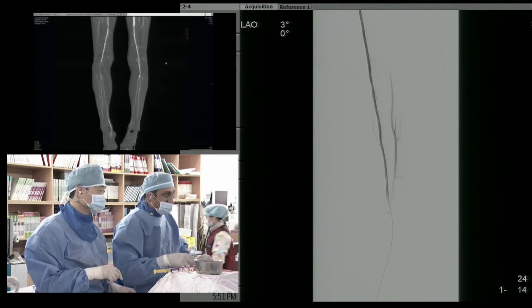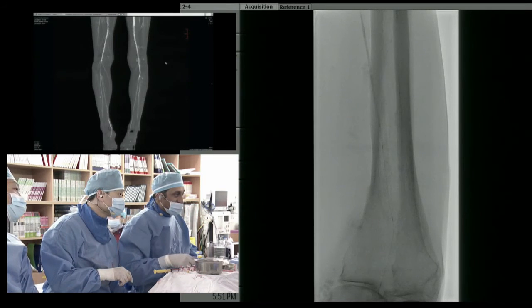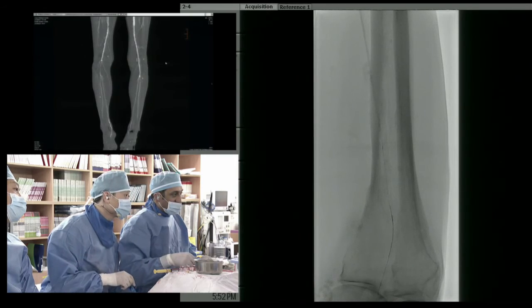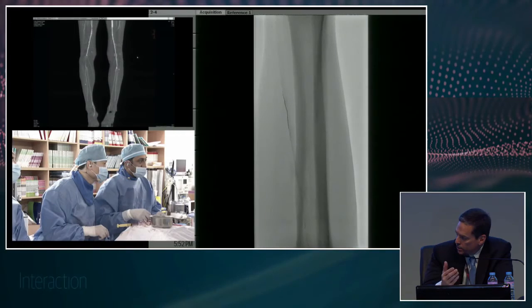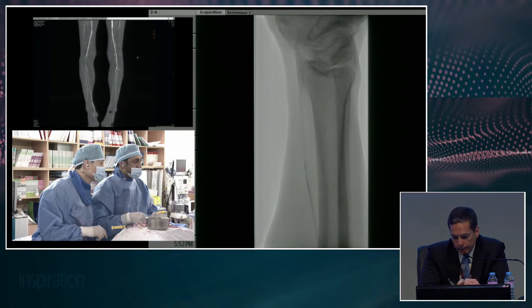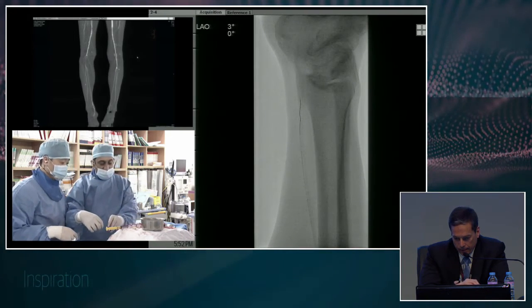I think the collateral vessel is relatively quite big, so a 2 balloon is very small for this patient. Yeah, I recommend a bigger size. Well, I think they're now at a crossroads, right? The question is, do you stick with an atherectomy approach or just stent it? I think this is all inflow that's not allowing the outflow. Yeah, I agree. I'm still going to try the atherectomy approach.